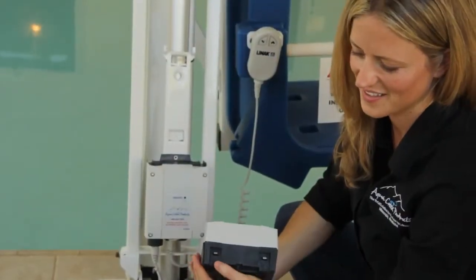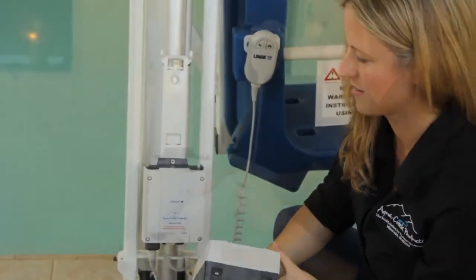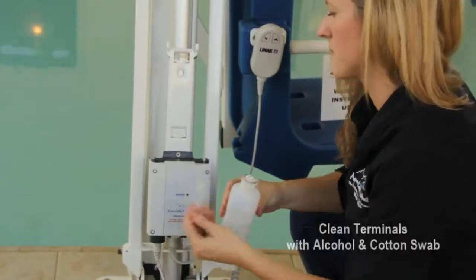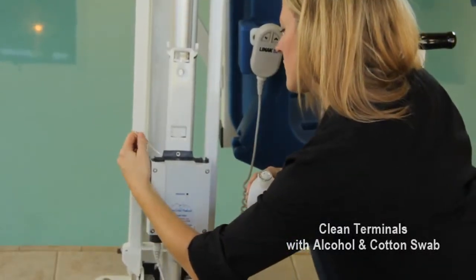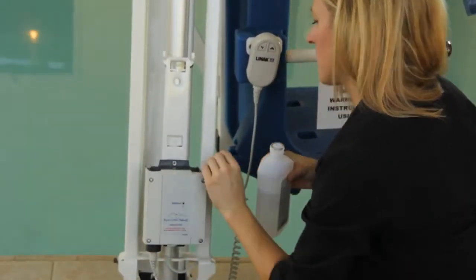If your lift is still not working, check the battery and control box terminals for any corrosion. If needed, you can clean terminals with an alcohol wipe or a cotton swab with alcohol.